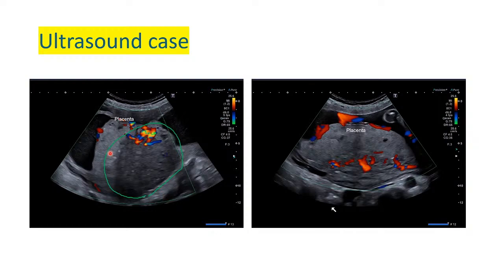So look, after some minutes, I read the sonar, and you can see here the placenta there, and on the posterior part or in the retroplacental space, the Braxton contraction is gone. It has disappeared, so it's now smooth. So you can see what we have here. It's only the blood vessels in the retroplacental space. So in the retroplacental space the mass is gone.